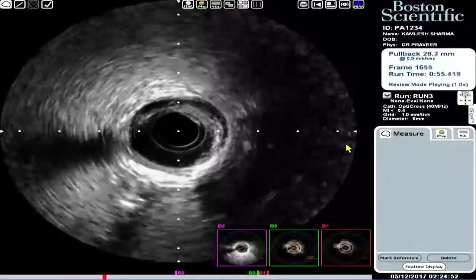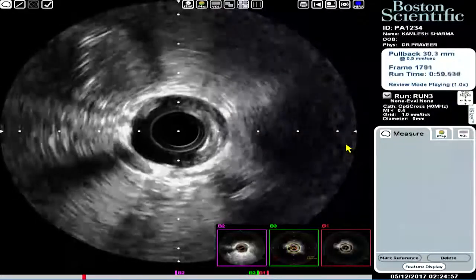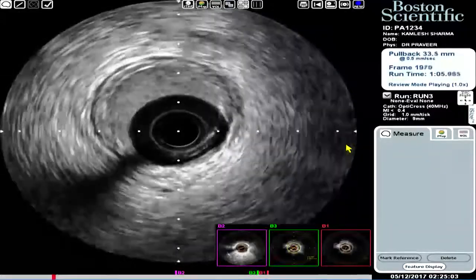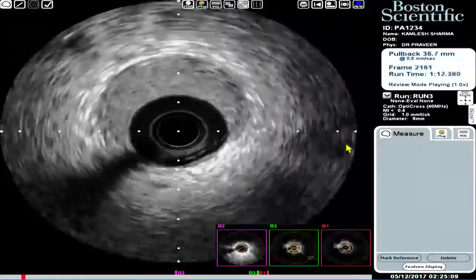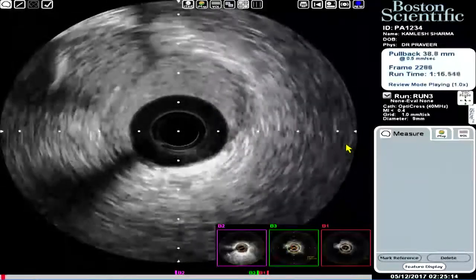So you have an outflow plaque disruption and a small vessel. You have a 2.0 stent which is underdeployed, and the proximal 2.5 stent is also underdeployed, and a large proximal circumflex. Which lends to a recipe for further events. You've already had one event, but acute occlusion.